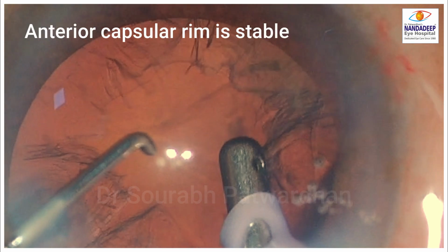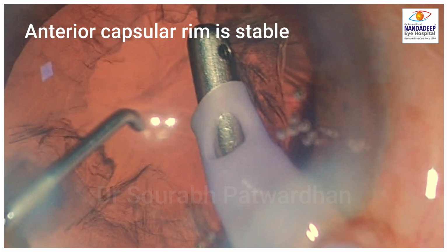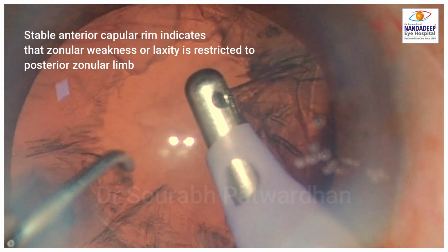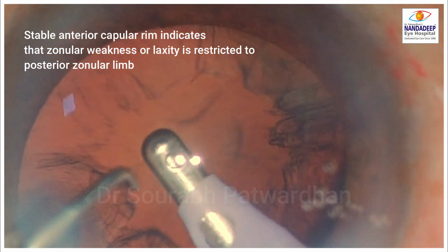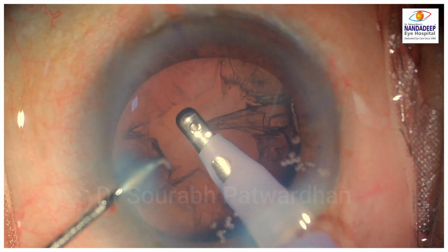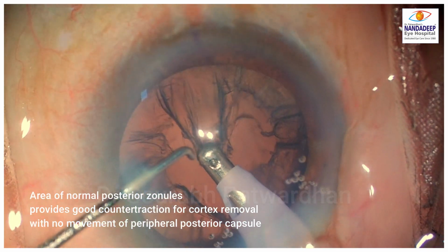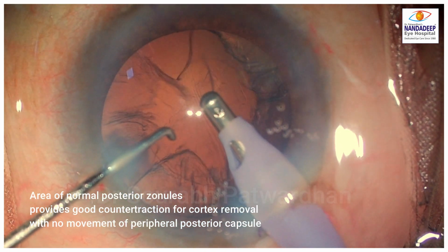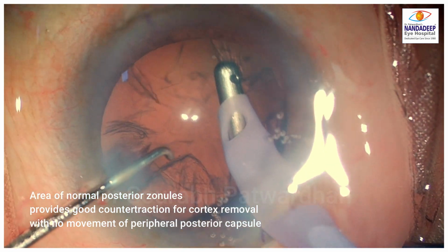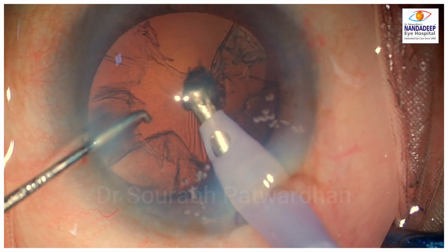At the same time, the anterior capsular rim appears stable and there is no movement of the anterior capsular rim. A stable anterior capsular rim indicates that zonular weakness or laxity is restricted to the posterior zonular limb here. Now we move on to the area of normal posterior zonules. You can see that the posterior zonules provide good counter traction for the cortex removal with no movement of the posterior capsule in the area where the posterior zonules are strong.